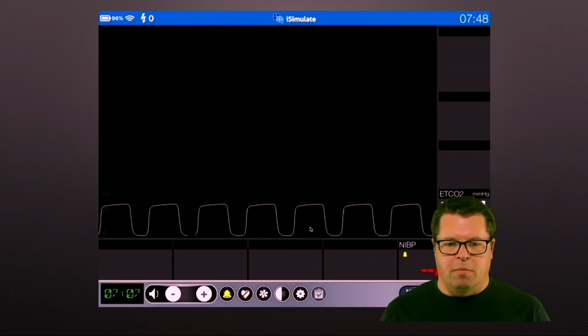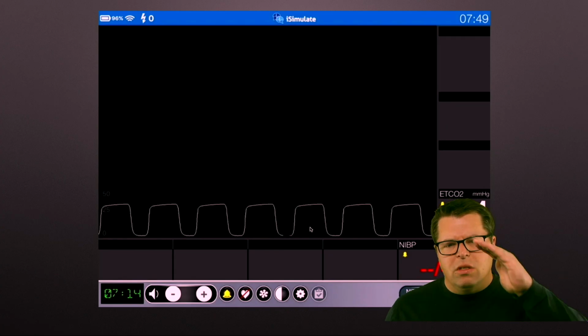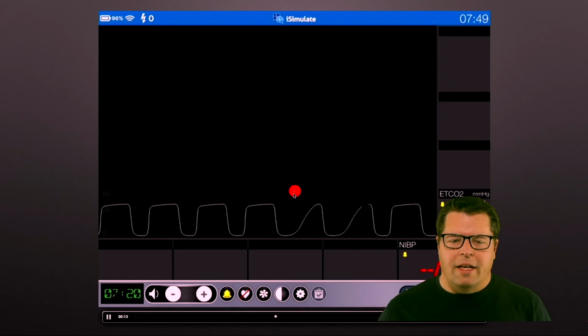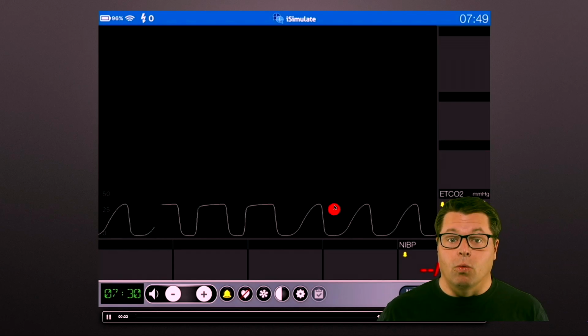How about this particular one? Again, this is normal looking here, and then let's say we're going to switch over here in just a second. What we saw was a gradual little curve up into it. The more obstructive your lungs get, the less time you have to actually make this plateau. So we're blowing out more and more CO2 the entire time. All this is showing is that you are getting worsening obstructive disease or worsening obstructive pattern. It's taking longer and longer.